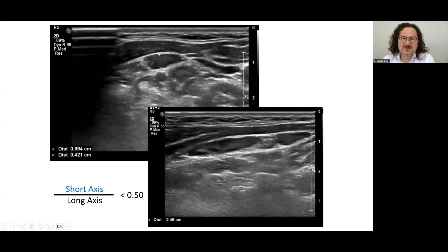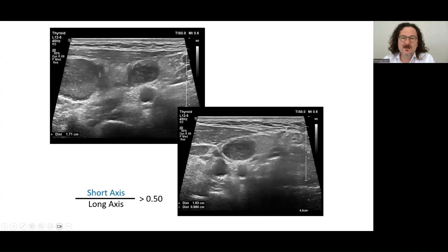Here are some examples. The transverse plane short axis and this is the long axis. This means a flat or oval lymph node. This is a spherical pathological lymph node — short axis and long axis measurements.